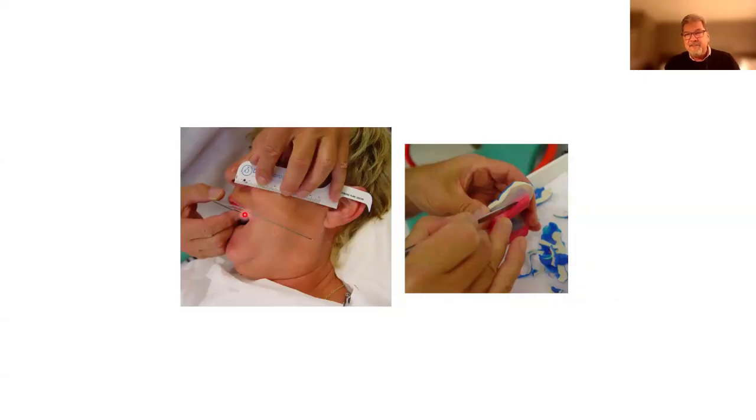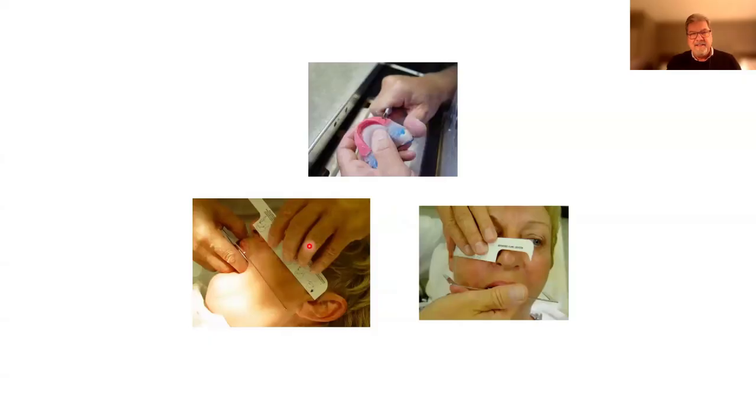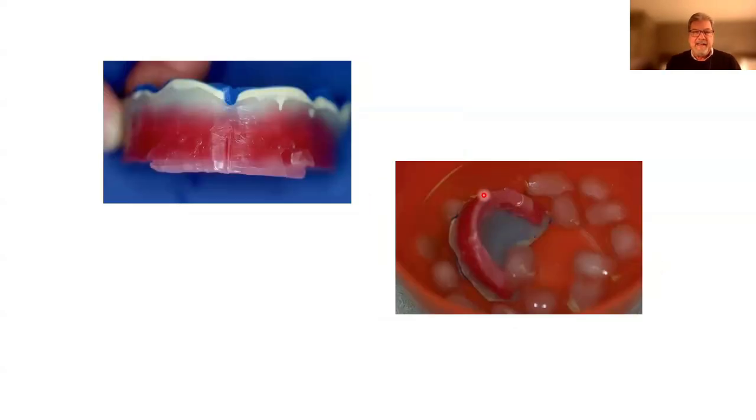So what do we have to do here? We have to trim that posterior region of the wax to have an even occlusal plane. So the doctor's trimming the wax, puts it back in the mouth, and now we have a good occlusal plane, and we can take the bite registration. So we have the Camper's plane here, nice occlusal plane. That's going to give us the correct information. This way, we're not going to be setting up these teeth in a reverse spiral situation. And the doctor can add some extra wax if he wants to show more anterior teeth, the incisal edge, so I know exactly where to go here when I'm setting my denture teeth.